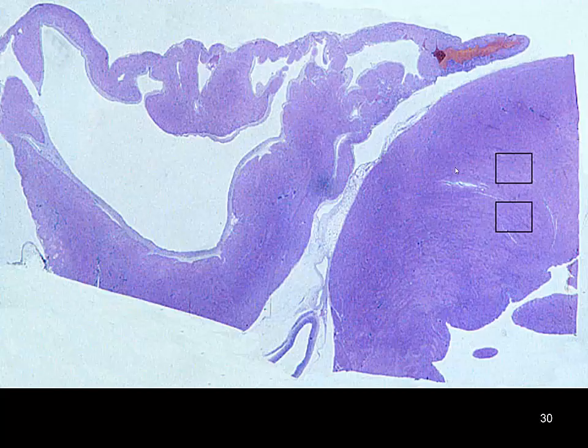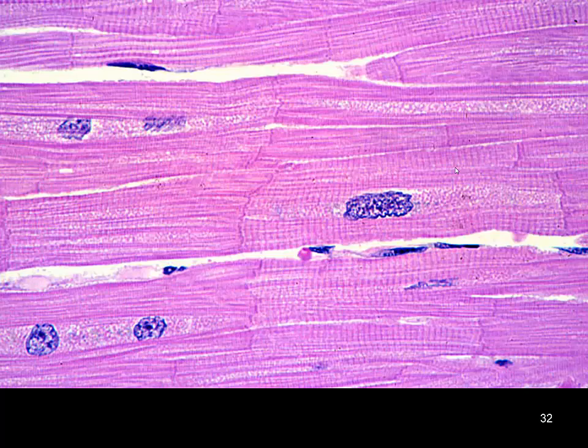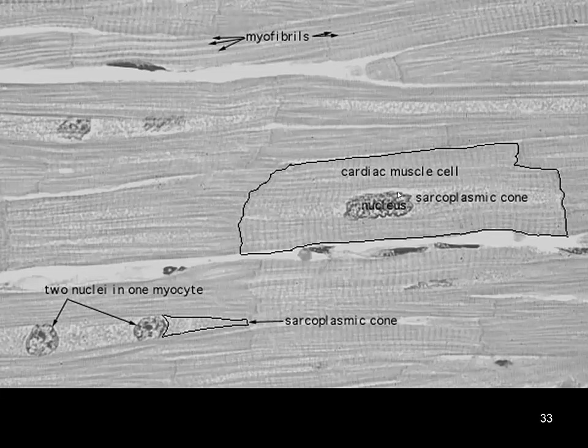So we're going to look at cardiac muscle. Here we have some large sections of cardiac muscle. This is a low magnification view of atria and ventricle. And as we look closer at tissue, we are going to find those characteristics. We see the intercalated disc running between them. Here we see our striated pattern. It's going to be offset as these cells branch in and out of the plane of section. And here we have our large centrally located nucleus. But the intercalated disc by far is the easiest characteristic to pick up on and identify.